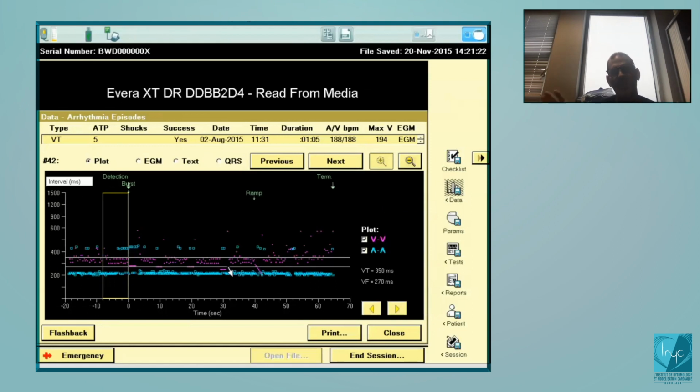So in this case, okay, just burst, but you see that you were quite close in this patient to receive inappropriate shocks. Okay, 5, fibers, and maybe at one time he could have received. So that's the problem with all this algorithm. Even if you have a sensitivity or specificity of 99%, the remaining 1% can be a problem.